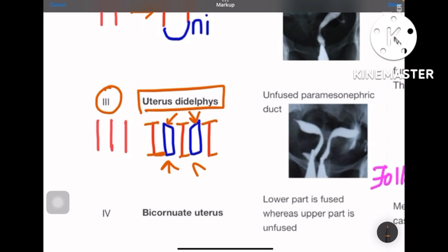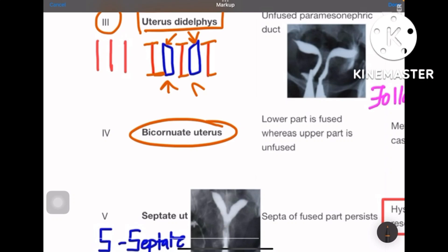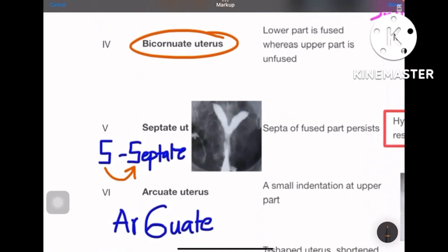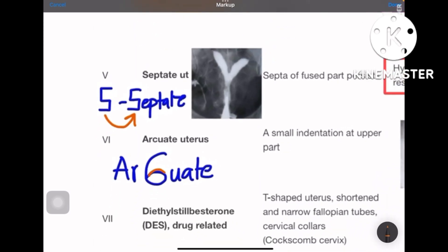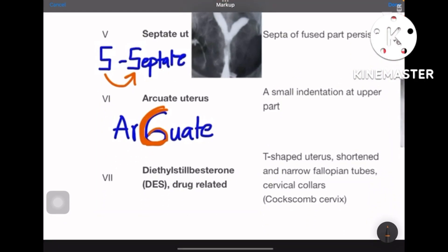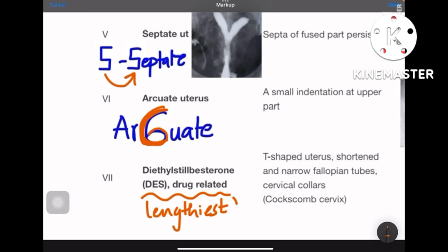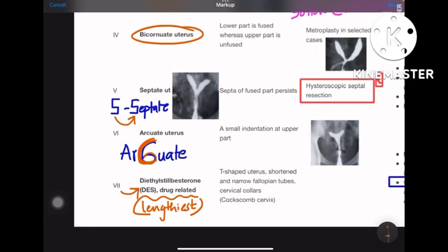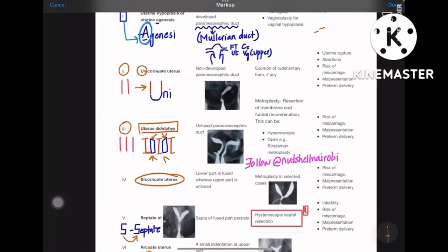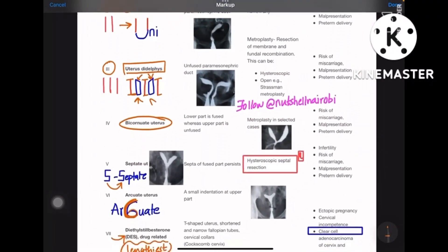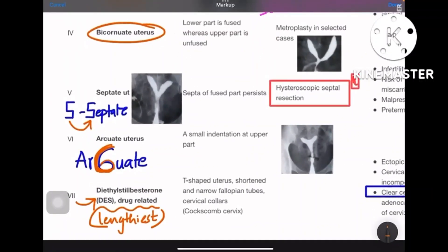Class 4 is bicornuate uterus. Class 5 (phi) looks like 'S,' so phi is septate uterus. Class 6 is arcuate — you can make a 'C' (arc) out of a six. Class 7 is diethylstilbestrol (DES) related — it has the lengthiest name, so the largest class number gets the longest name. Summary: 1-agenesis, 2-unicornuate, 3-didelphys, 4-bicornuate, 5-septate, 6-arcuate, 7-DES.